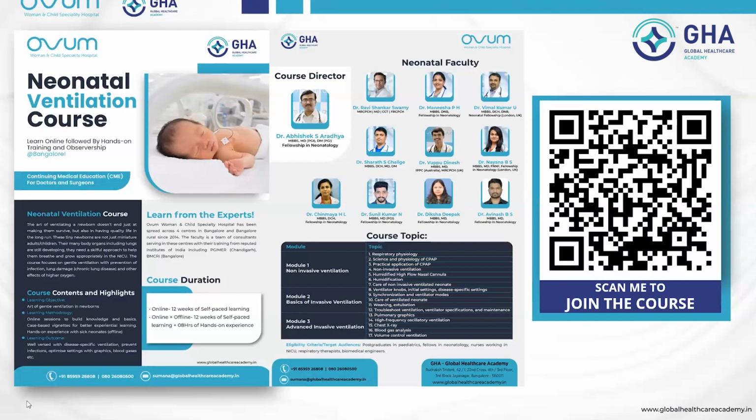I'll close the question answer session there. Most of the questions are repeating. They're asking, if you want to give a PEEP of 4, is it inside 4 or outside 4? What number should be visible in a bubble CPAP? Whatever is seen at the tip of the jar is the level.